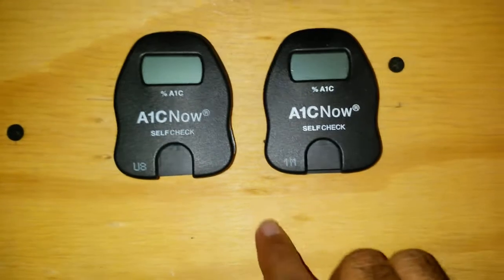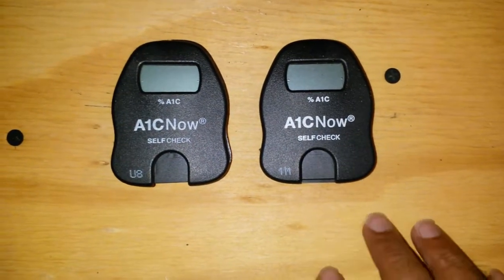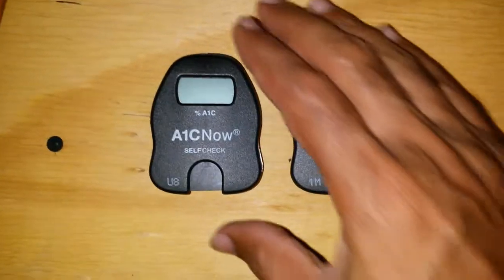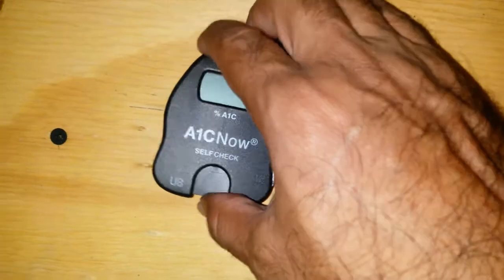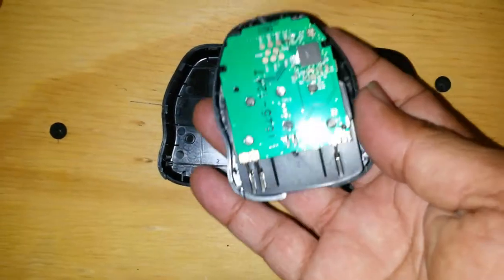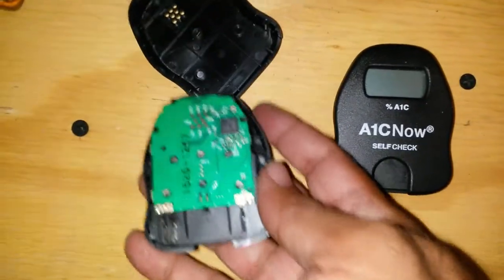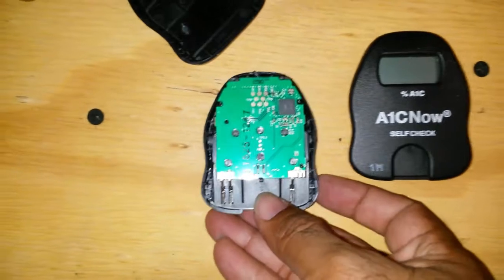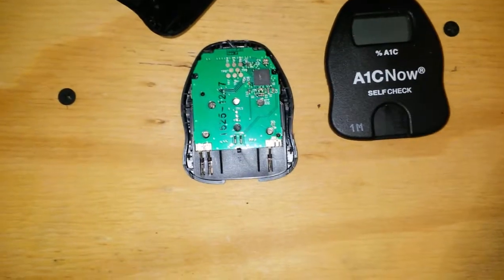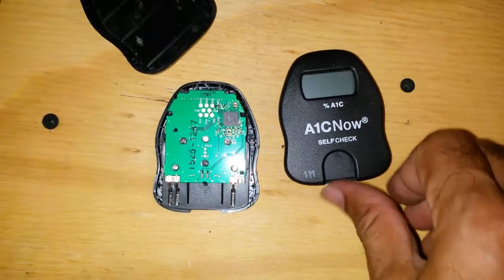Well, look at these A1C self-checking machines. These come with two tests and essentially disposable machines. I opened one up a long while ago, and it was quite interesting actually. I'm going to open back up this one too, simply because I interfered with the actual chip inside here, and I damaged it, and it can't really be fixed. So if I can get a better picture on the microscope of this one, I'll go for it.